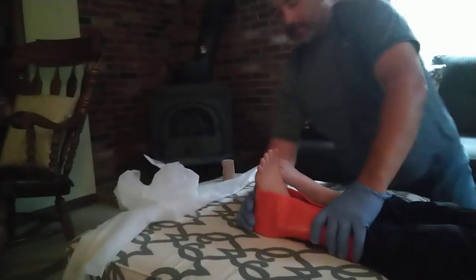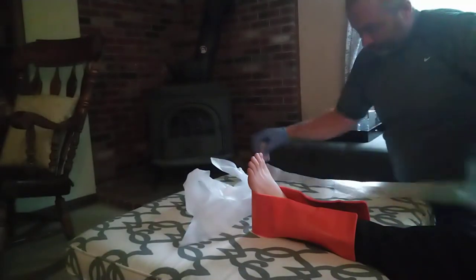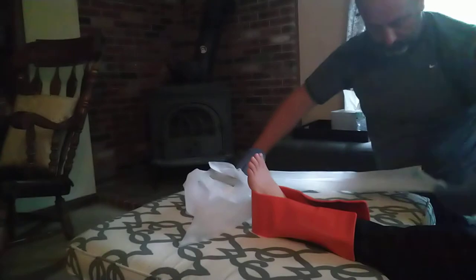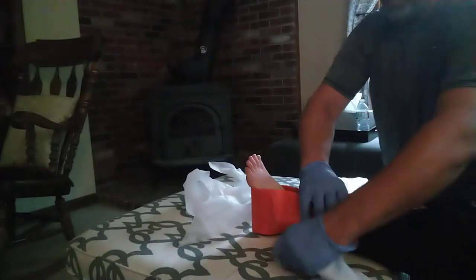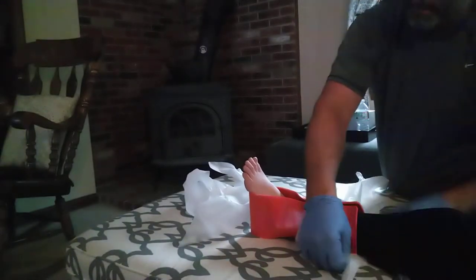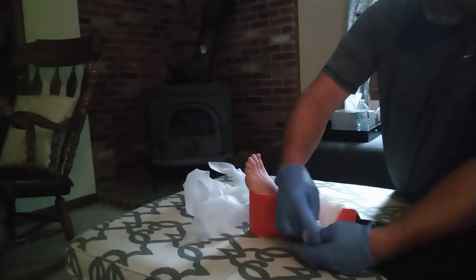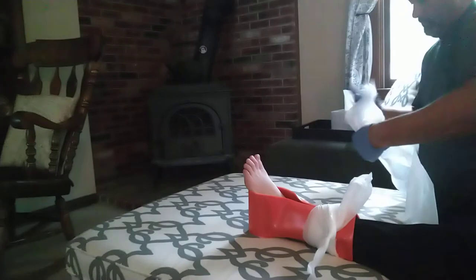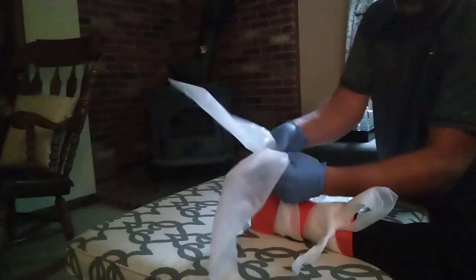So I put this on. Here I would just guide this under. And tie it on a bit. Same thing — right on it.